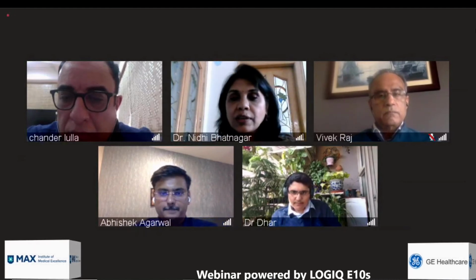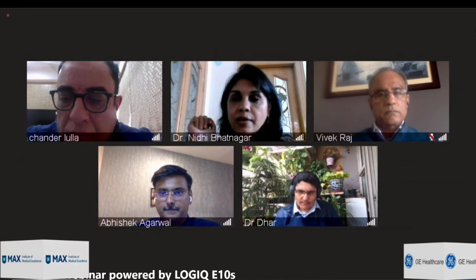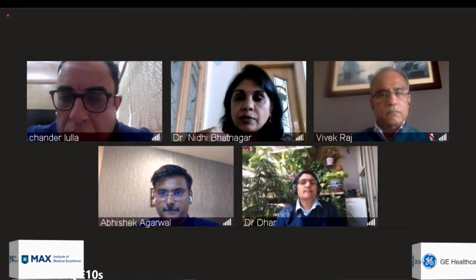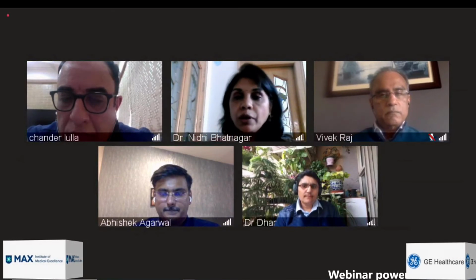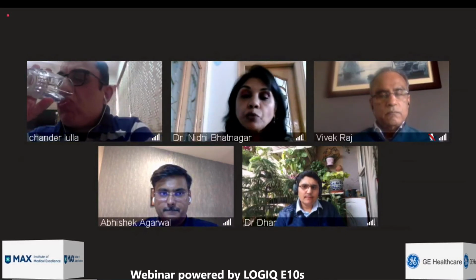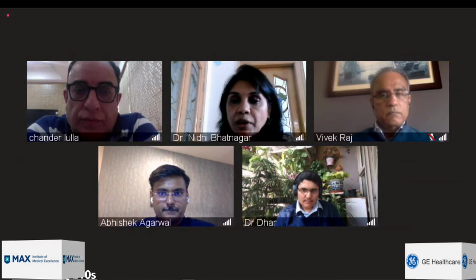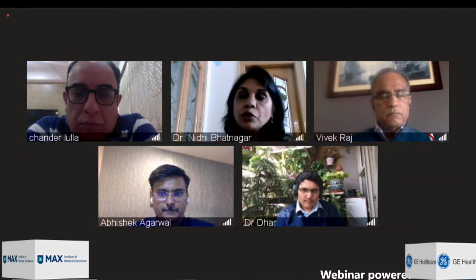And then Chander said, which was a very important point, and you raised the same point, about vision: how are you going to go past that blood vessel? How are you going to go past that lesion? There was also a question asked by Mridula Bapat, who is also doing transient elastography, and she asked a very specific question: Ma'am, can we do elastography in ascites? Yes, of course we can. Why can we do it with shear wave elastography and not with transient?